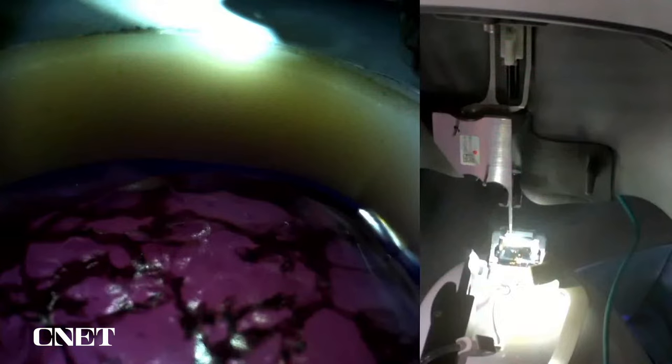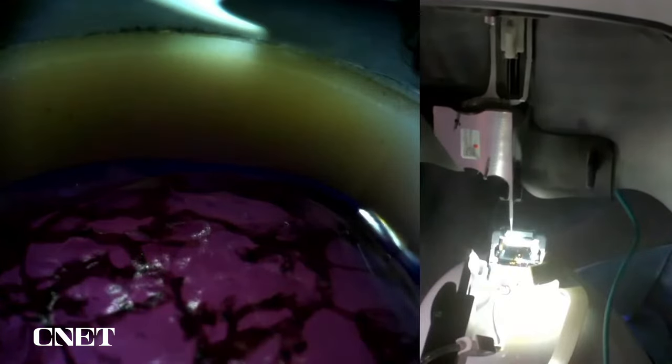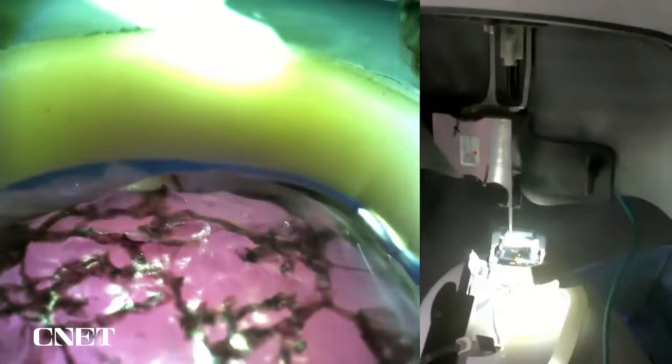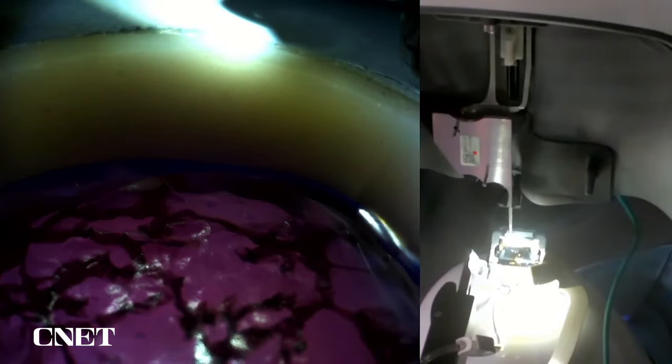What you're seeing are these hash marks with numbers that represent where we intend to put each of our threads. On the left is the view of the insertion area, and on the right, what the robot is going to do is peel the array threads one by one from its silicon backing and insert them into the targets we pre-determined in the targeting view.